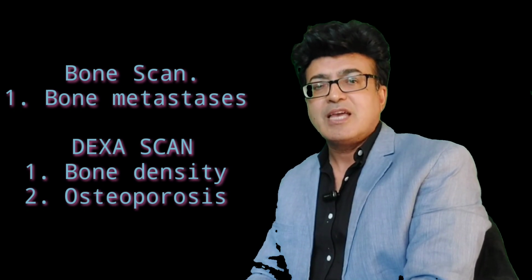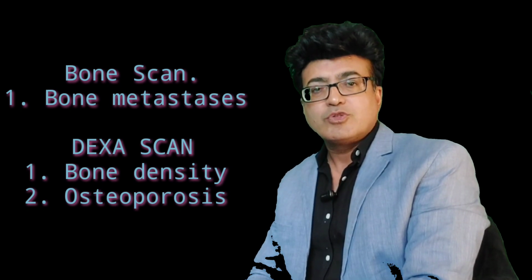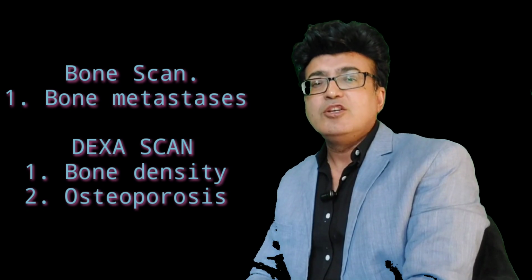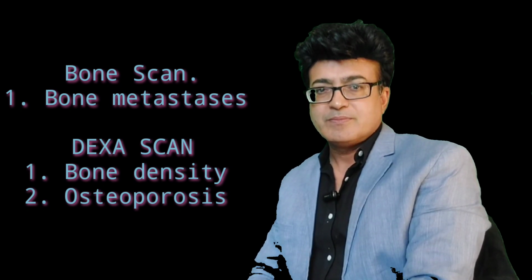Besides this, there is another scan which is called the DEXA scan. The DEXA scan is used for the detection of osteoporosis, or if there is a need to know about the bone density. So for the detection of bone density and osteoporosis, the DEXA scan can be used.